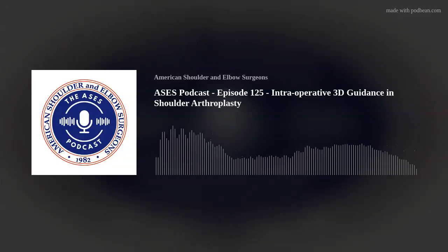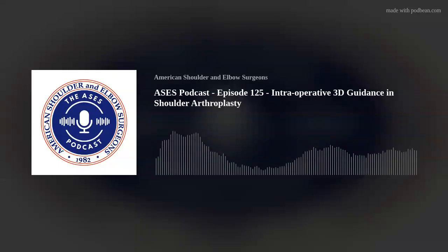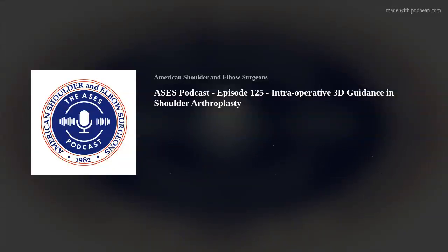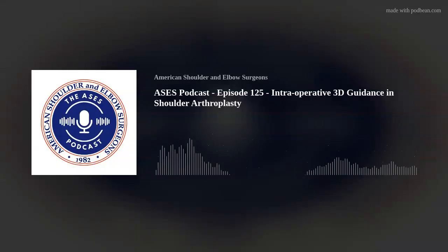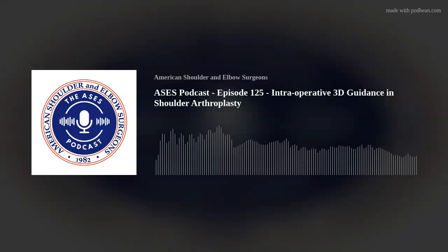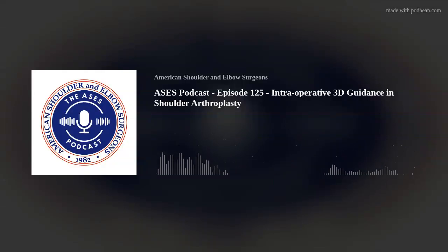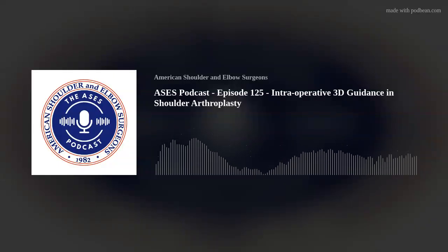When I talk about this, one of my favorite things to say is, 95% of orthopedic surgeons think they're in the top 5%. So I think we all think we're better than we actually are. And when I was young in my practice at University of Florida, myself and Tom Wright did a study where we would essentially register the scapula with the GPS unit, and then we would simulate placing a guide pin down our axis of the implant, similar to what Tom would do with his implant with the Biomet, where you put your central pin in, and then everything goes from there. And Tom and I both performed the same, despite him having lots more gray hair than me. We were both off in a third of the cases, a clinically significant amount.